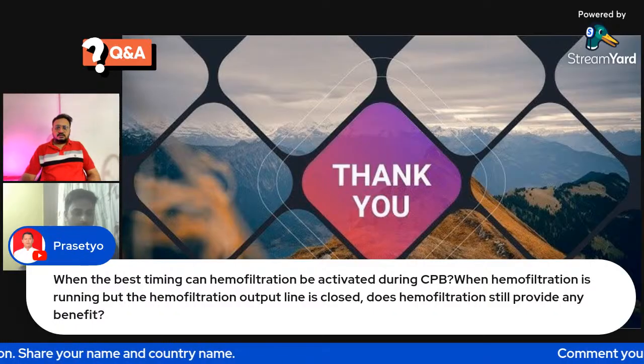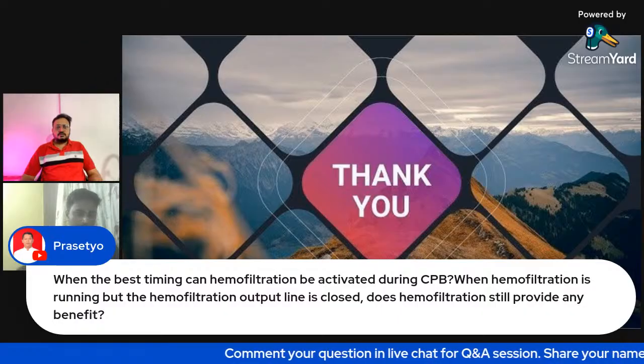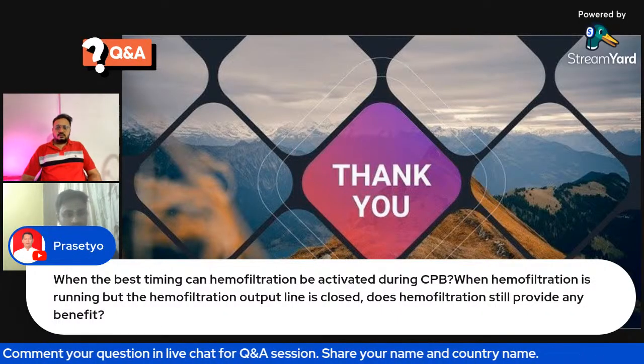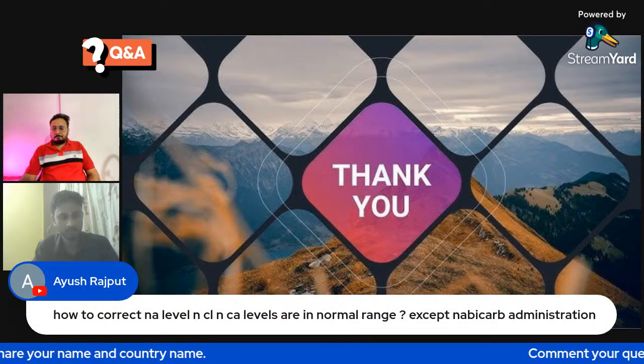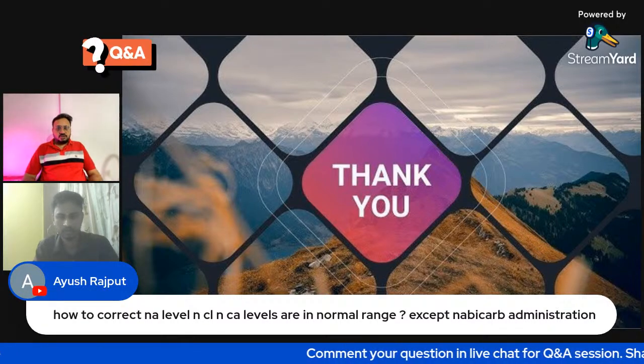If we apply outlet pressure, it will reduce the blood flow; it won't increase it. Instead of clamping the outlet, applying a vacuum to the suction jar is useful, sir. Okay. So we'll go to the next question.